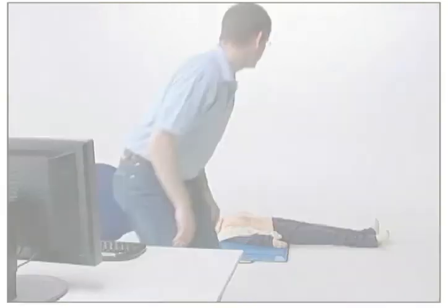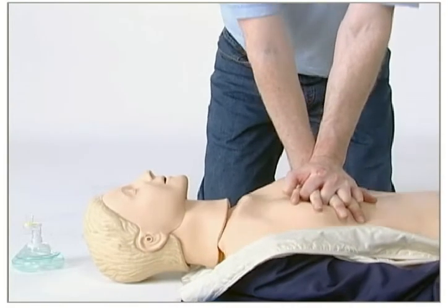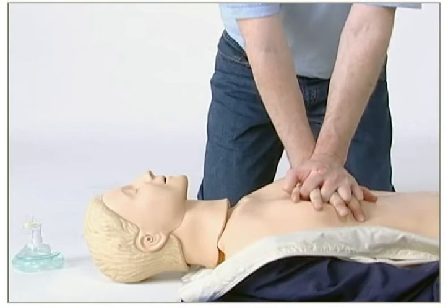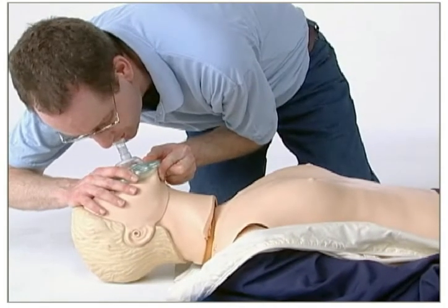The computer will instruct you during the exercise. Please pay attention to the instructions, but do not stop performing CPR. Open airway and give ventilations. Remember to give two ventilations.